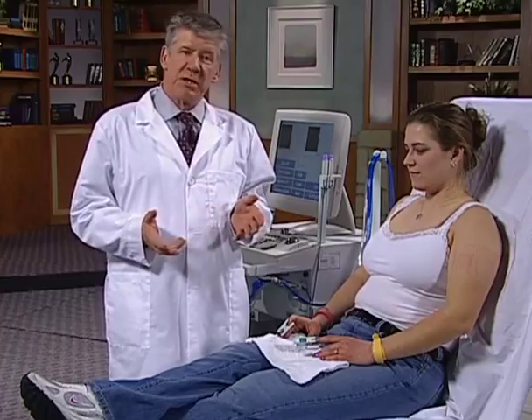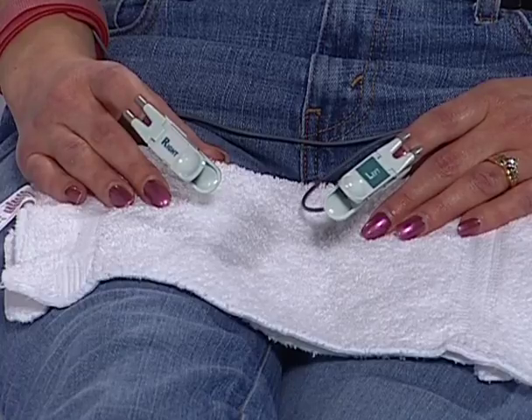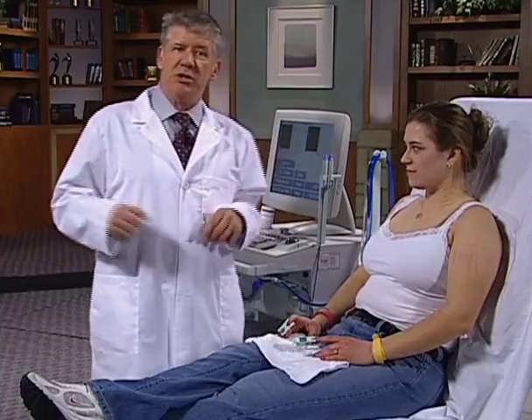So for this method, we can use either pulse volume recording, although there's a lot of artifact with pulse volume recordings when their arm is in different positions. I prefer to use PPG placed on the index fingers. For the sake of this demonstration, in camera angles, etc., we're just going to demonstrate the right side. Normally, it's a very easy test to perform in a bilateral manner using bilateral PPG channels.